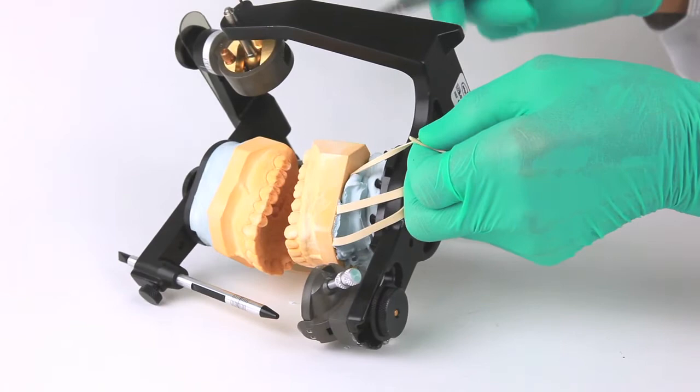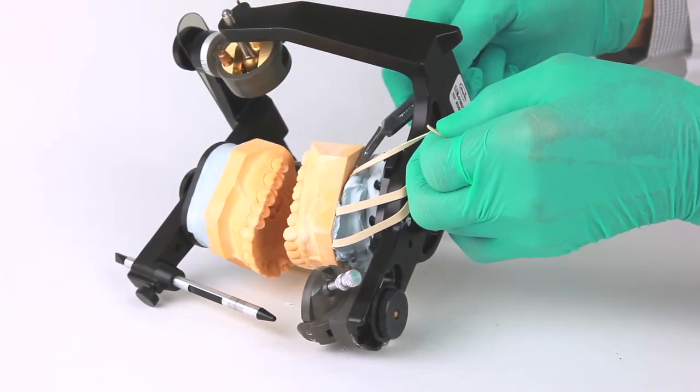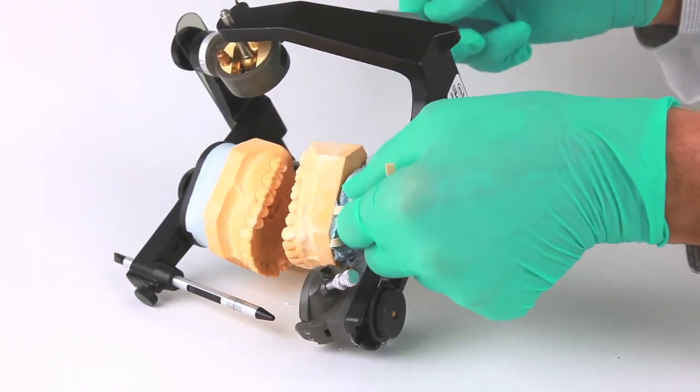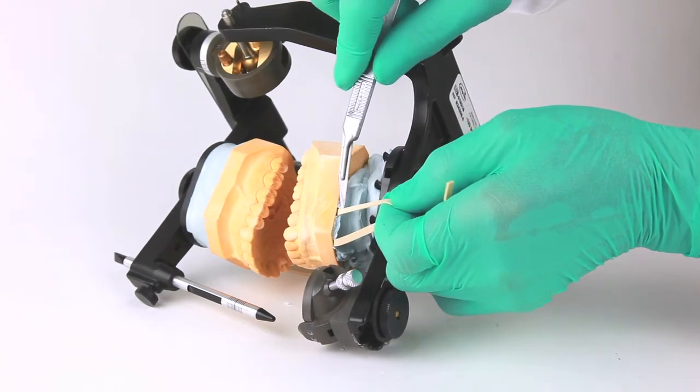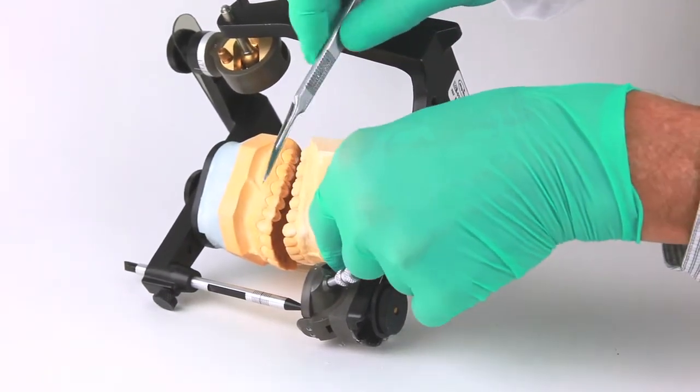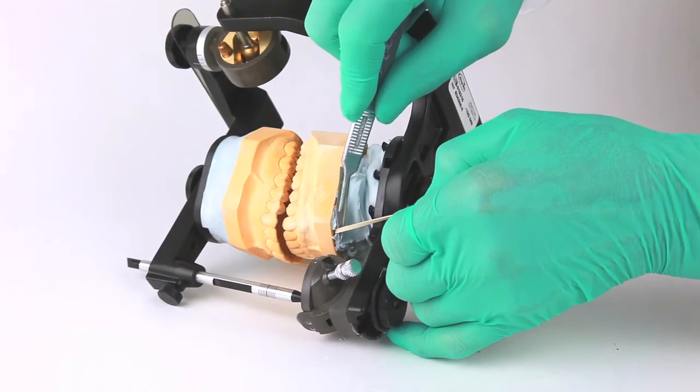The articulator can be easily repositioned for easy access to the flexi-mount attachment arms. With the individual arms stretched tightly, they can be easily cut at the base of the cast by using a sharp laboratory knife.